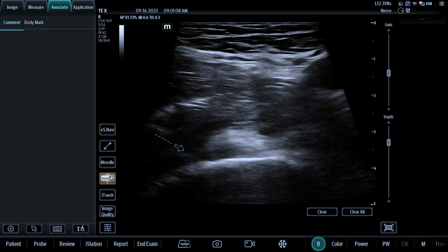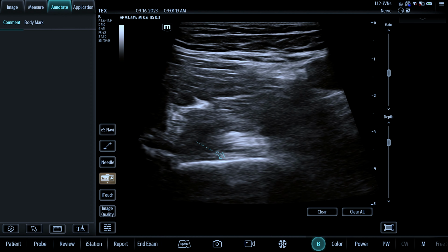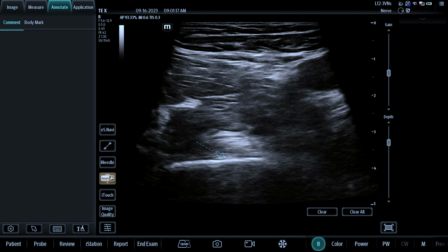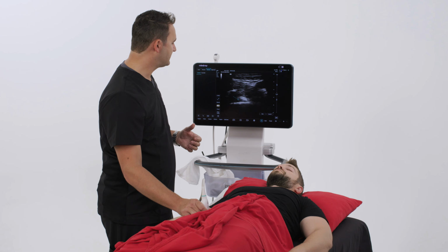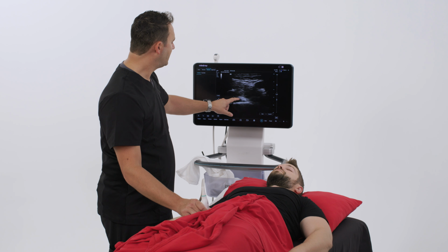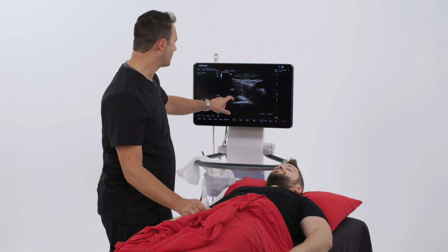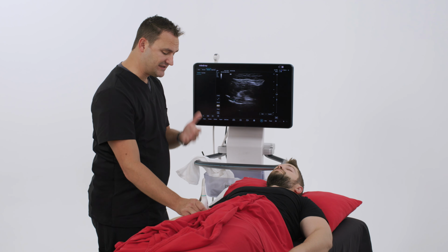If you can get to the lateral side, you can dump all your local anesthetic there. I generally put 20 to 30 cc's of local anesthetic there. I'll use 25 cc's of local anesthetic here because I'll use the other 5 cc's to either get the anterior femorocutaneous nerve for anterior hip arthroplasties, or 5 cc's for a LFCN nerve block, which I'll show you shortly, for a lateral hip arthroplasty. This is the technique I use for a linear probe.